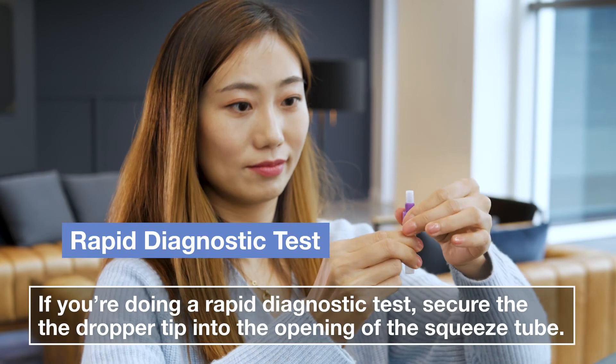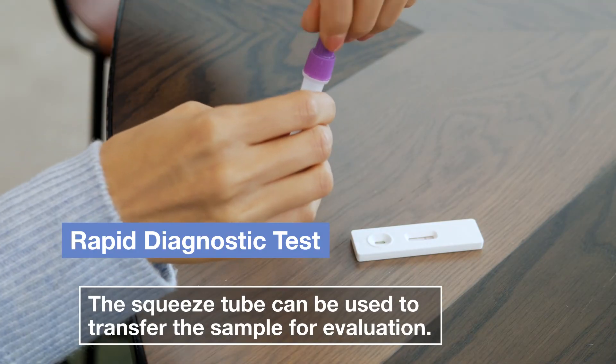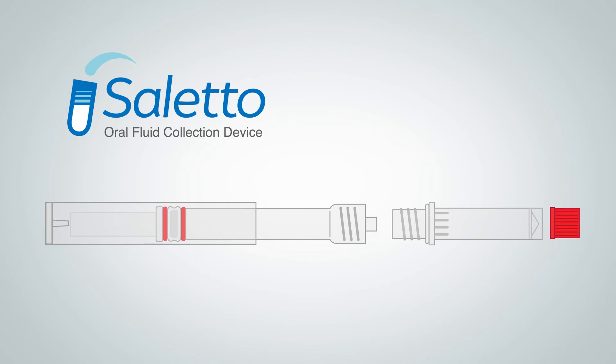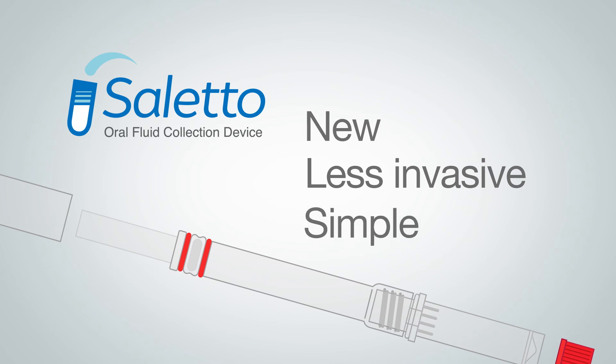Or, if you're doing a rapid diagnostic test, secure the dropper tip into the opening of the squeeze tube. The squeeze tube can be used to transfer the sample for evaluation. As you've just seen, the Saletto oral fluid collection device is a new, less invasive, simple way to collect saliva.